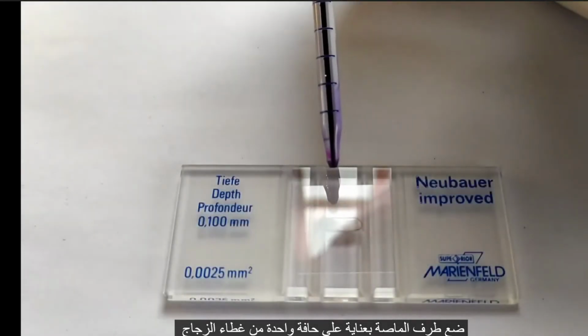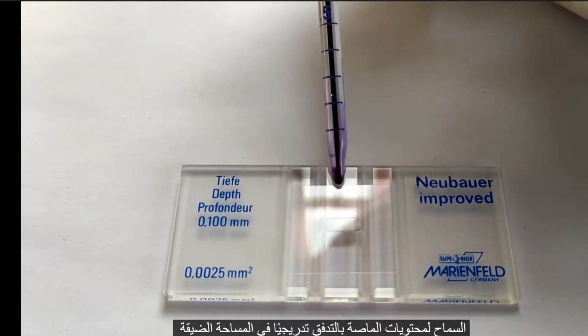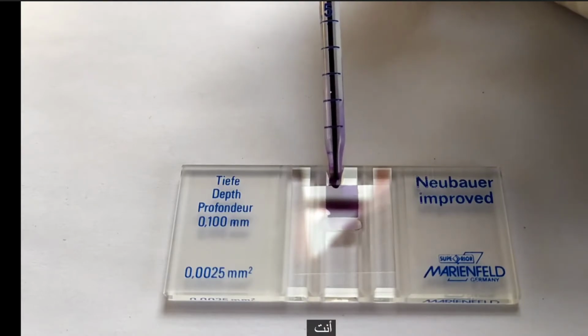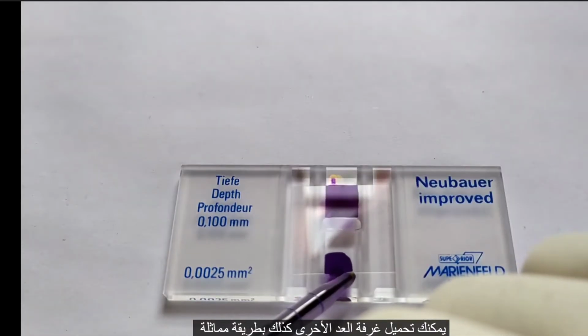Carefully position the tip of the pipette on one edge of the cover glass. Allow the contents of the pipette to gradually flow into the narrow space between the cover glass and the counting chamber via capillary force, like you see here. You may load the other counting chamber as well in a similar fashion.